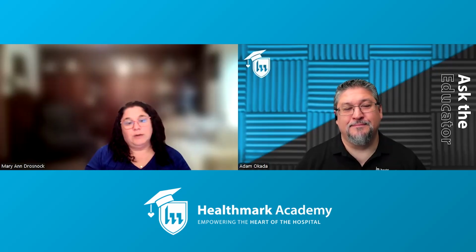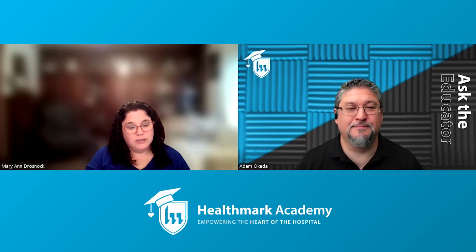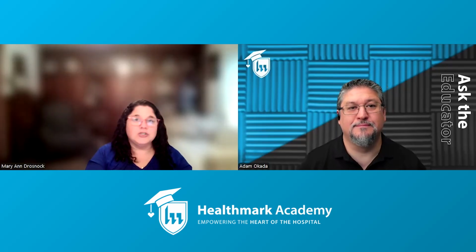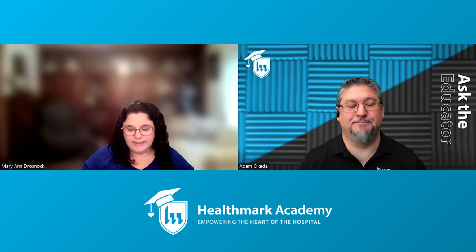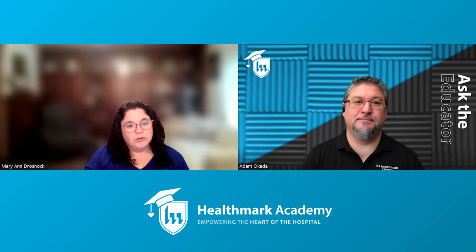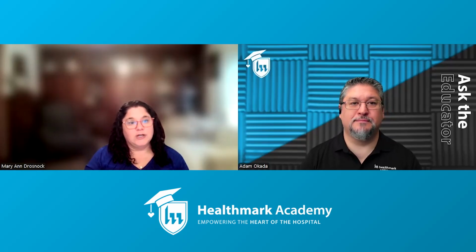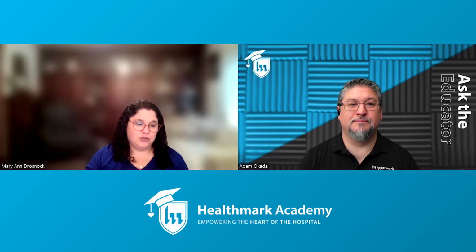But we owe it to our patients to do the best we can. And therefore, we need to do inspection after manual cleaning. You really should be looking at that scope every time you're touching it, right? You should be looking at it. But a distinct timeout to do a good quality inspection of that endoscope after manual cleaning, when you're doing your cleaning verification, is really key to preventing injuries and infections in our patients. We owe it to our patients to show, okay, this is damaged.